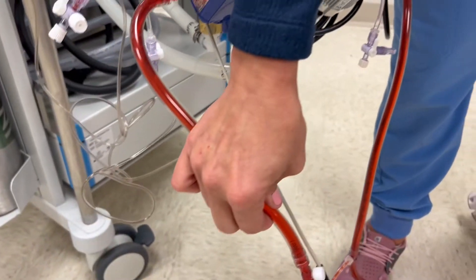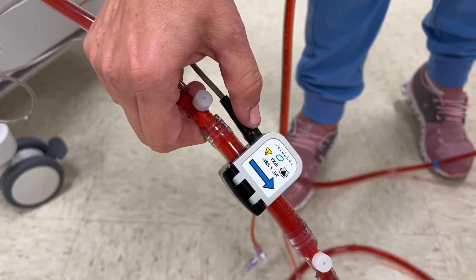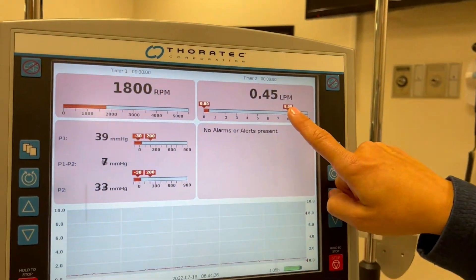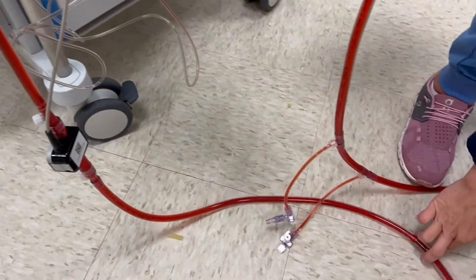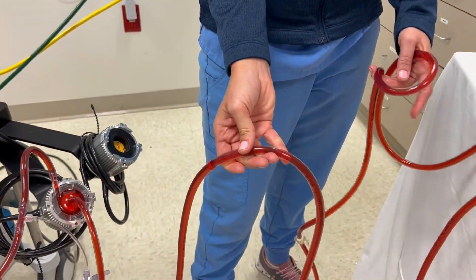Moving forward and going back to the patient, arterial blood is moving at a fast rate which is set by the flow probe, as seen on our screen here. The set RPMs give us the flow of what we're returning to the patient. We take our highly oxygenated blood back — differentiated by the red sticker labeled on the line — and it goes back up to the patient.